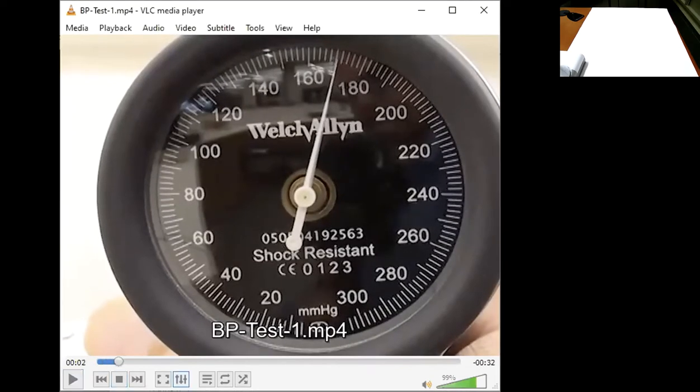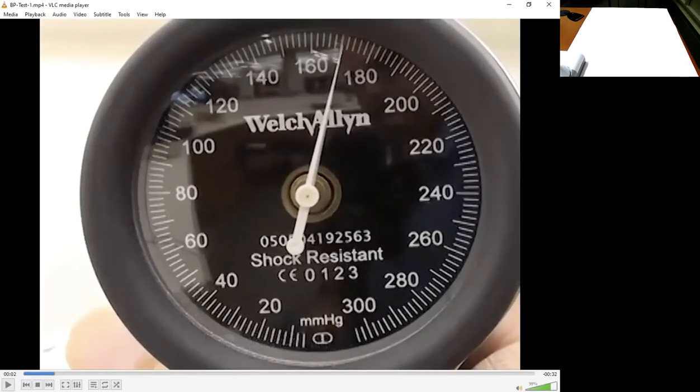All right, so in a second here, you are going to attempt to watch this pressure gauge. And the very first sound you hear as it deflates will be the systolic. The last sound, when the sound goes away, would be the diastolic. So are you ready? And remember, this is about accuracy. I'd like to see you get within about 2 millimeters of mercury of the correct answer. All right, so this is a challenge.